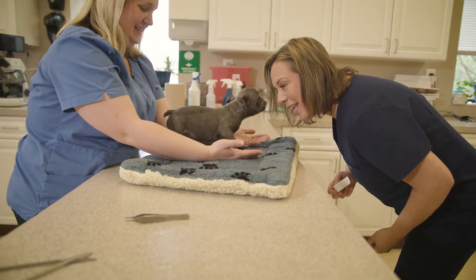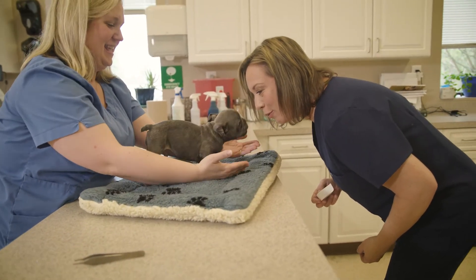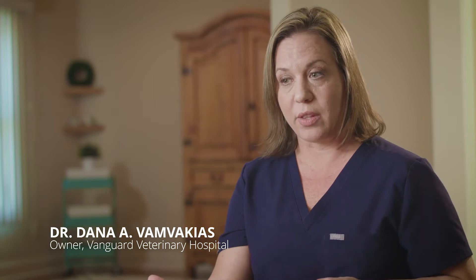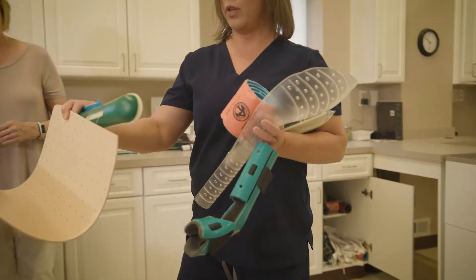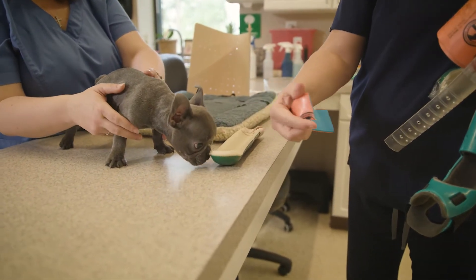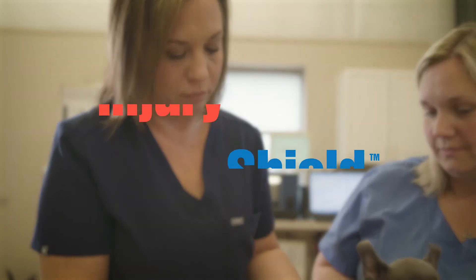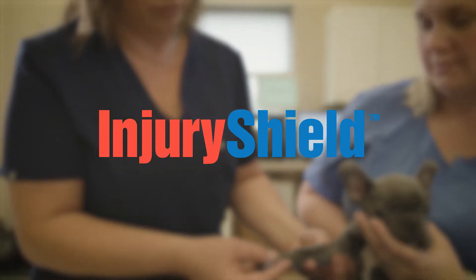The different splints we currently have on the market in veterinary medicine — some are very firm, hard plastic that we have to cut down and file edges on; some are spoon-like and they don't work on front and back legs accordingly. So you really are having to buy multiple splints for different sizes and legs, and it's not really cost-effective for a lot of small animal practices.